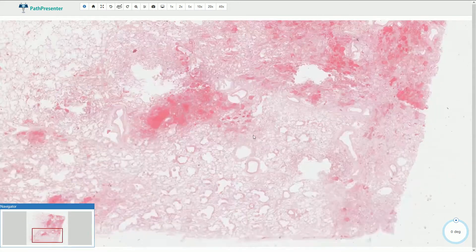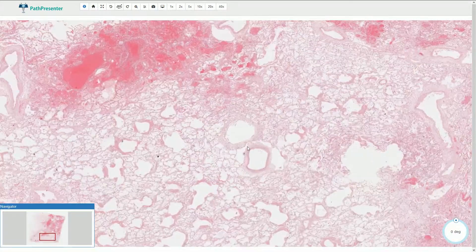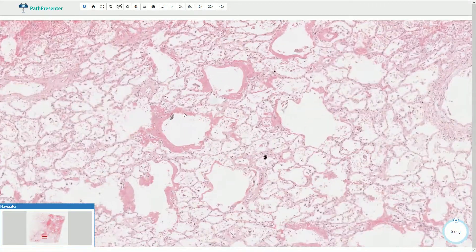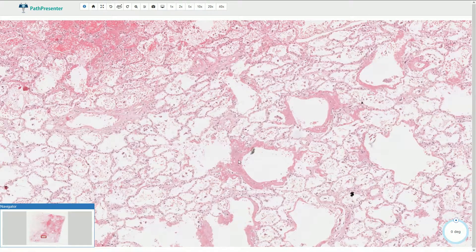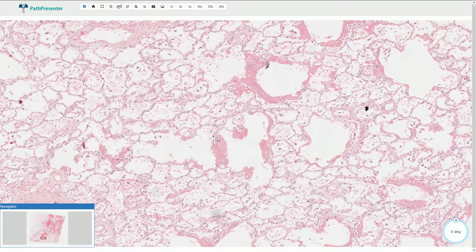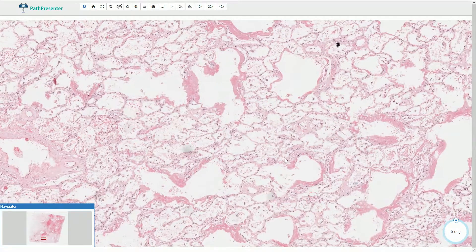If we go closer, we can find some hyaline membranes around the enlarged alveoli. This hyaline membrane disease is a typical morphological hallmark of diffuse alveolar damage.